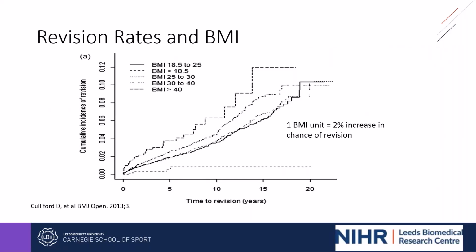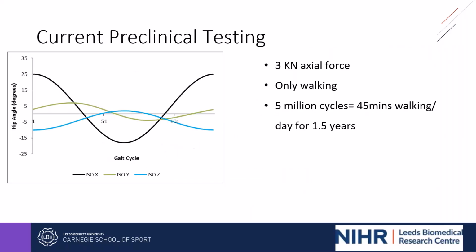But what we started to question was, why can't we predict this? Why aren't we predicting this at that preclinical level? So we looked back at how preclinical testing is done and what testing takes place, particularly with wear. And I know the standards are used for other aspects of preclinical testing, but we were focused on that aspect, which is the ISO 14242 waveform, which is what you can see on the screen here.